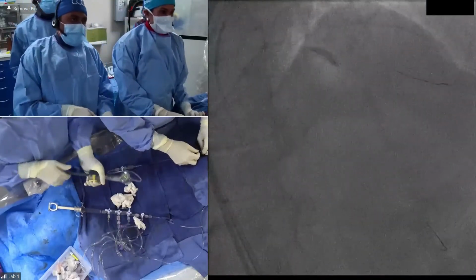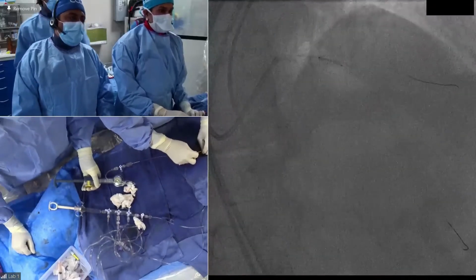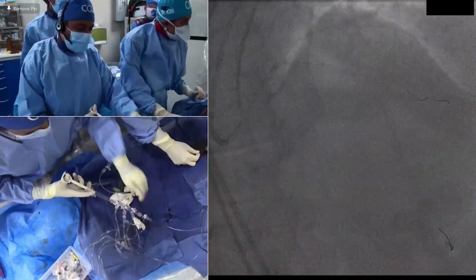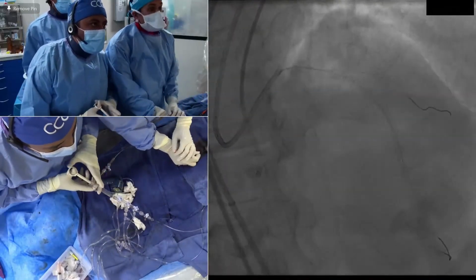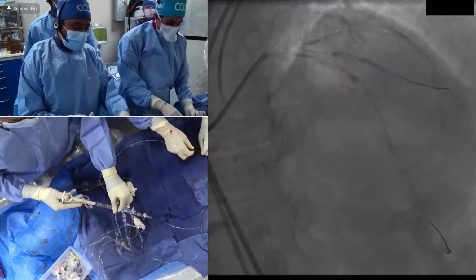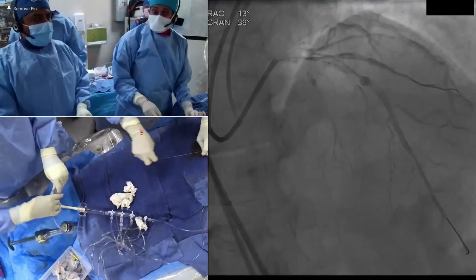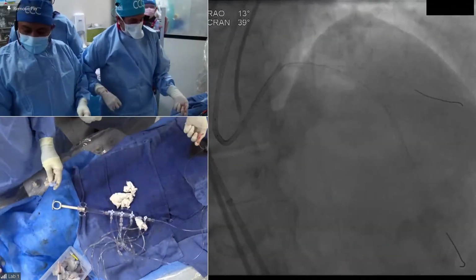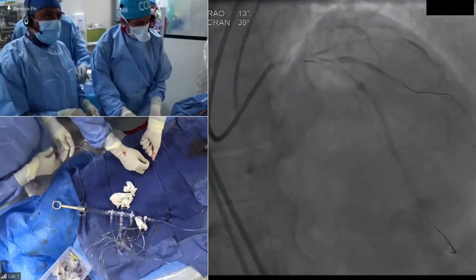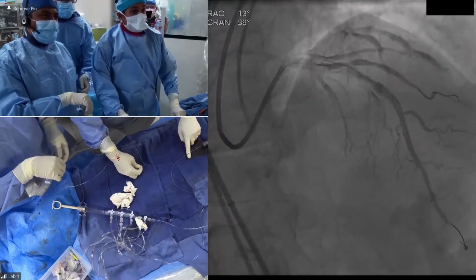Okay, down. So you see a chunk of calcium on the lower surface there. Let's see how the diagonal looks. Definitely it'll look worse, so we will have to do a cutting balloon right now. Flow is... okay, what's the cutting balloon we have? 2.5 cutter. The difficulty sometimes when you dilate over the LAD is you shift the plaque a little bit, and then the question is to pass equipment into the diagonal, particularly calcific. But let's see about that.